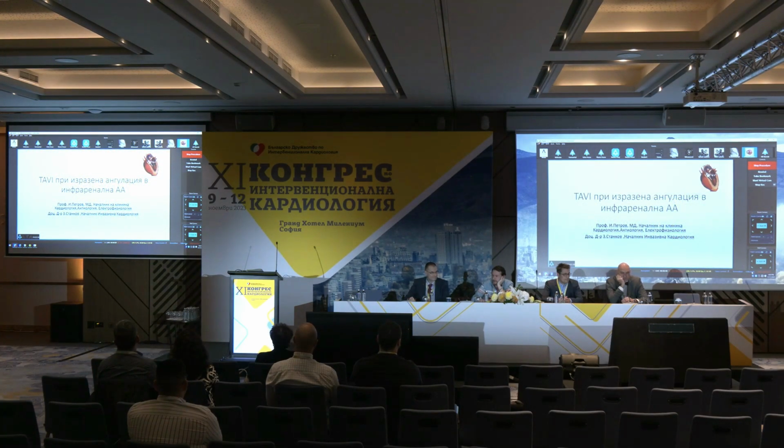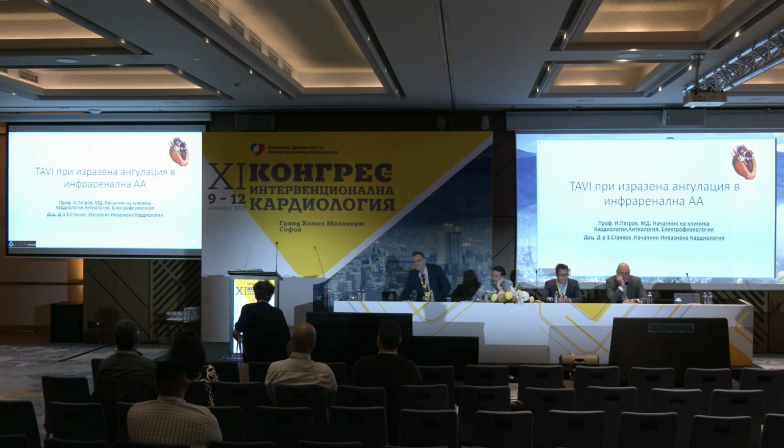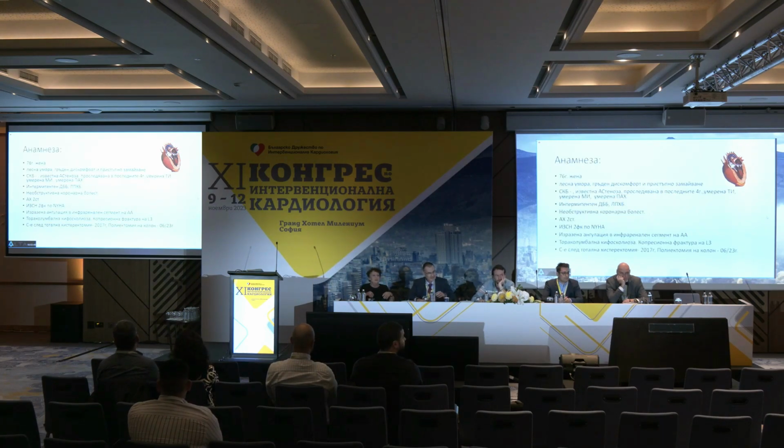Hello, guys. The next clinical scenario will be very complicated. It's about TAVI implantation in an extremely angulated infrarenal aortic segment. It will be presented by our invasive cardiologists, Professor Petrov and Docent Stankov. It's all about a 76-year-old woman. She's complaining of chest discomfort, tiredness, and dizziness. She has well-known aortic stenosis, which was followed in the last 4 years.